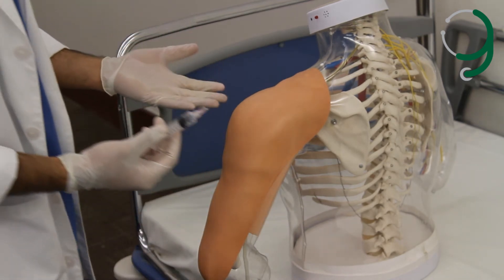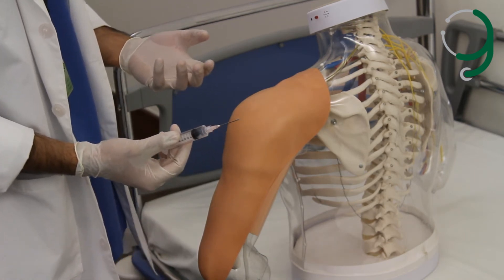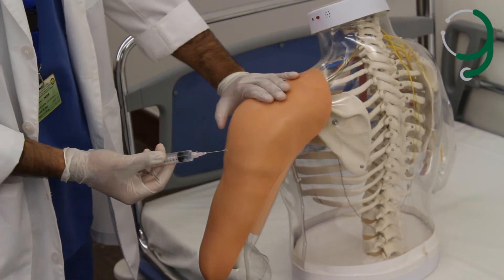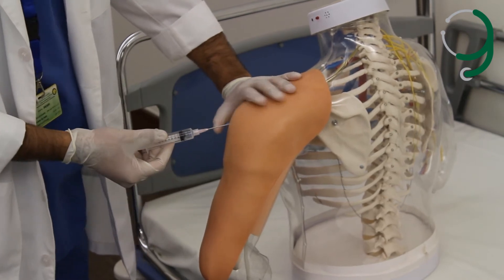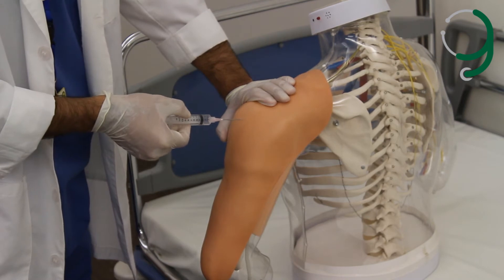For the deltoid muscle, we go three fingers below the acromion process. We use the Z-track technique for intramuscular injections, so we stretch the skin just a little bit. Then we inject quickly to reduce the pain.